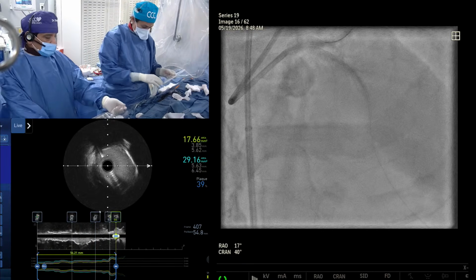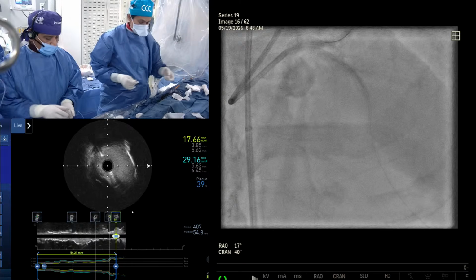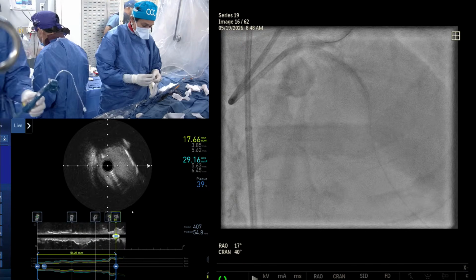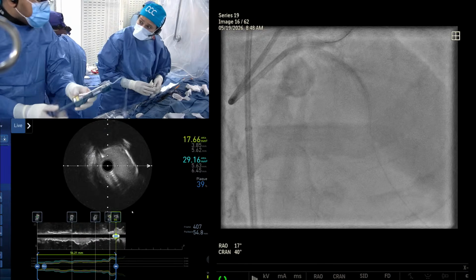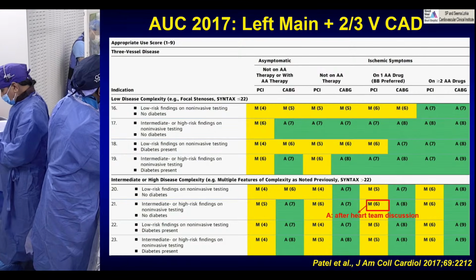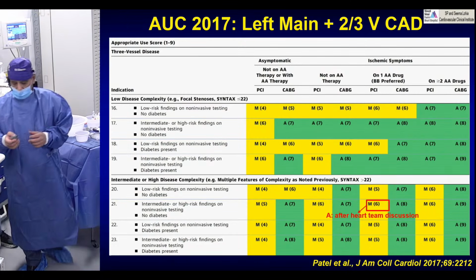All right, let's put this stent in. Yeah, 3.0 or 4.0, okay, good. And they're putting in 4.0, proximally optimizing with 4.0. Which one? 4.0 by 15, right? Yeah. Okay, go with your presentation. That's it. We will do the IVUS after. Then you will show it. So this was appropriate.